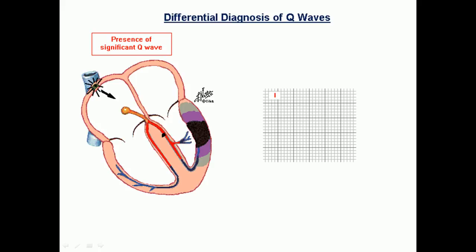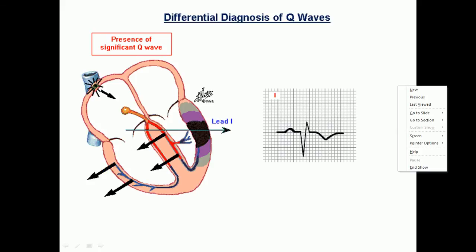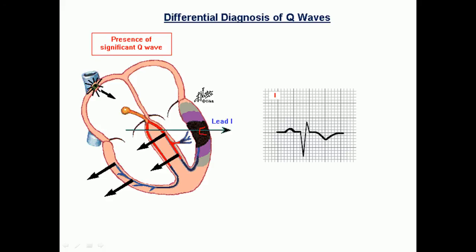As you see in this image, we will see three areas. The first is the black area in the middle. It is the indicator of the necrotic zone. The two purple zones beside this necrotic zone are the injury area, and the two gray zones beside this are the indicator of the ischemic area.